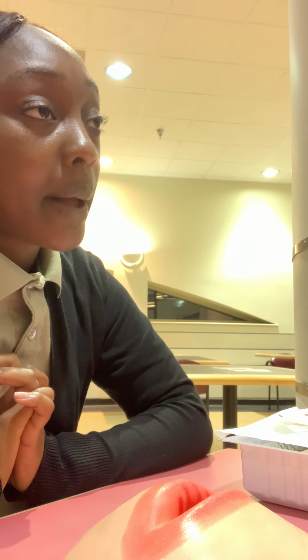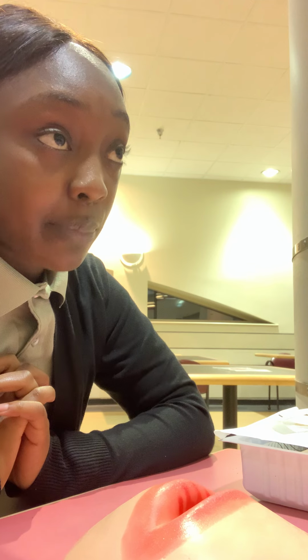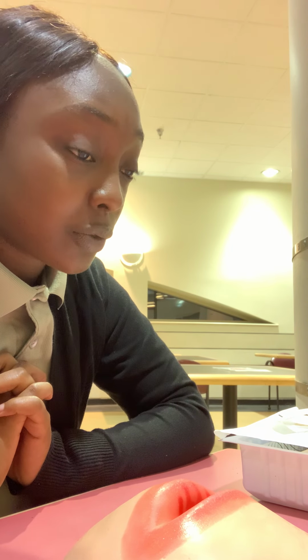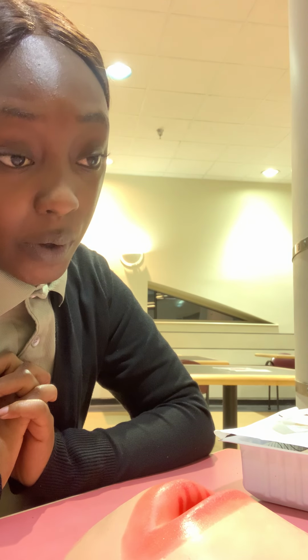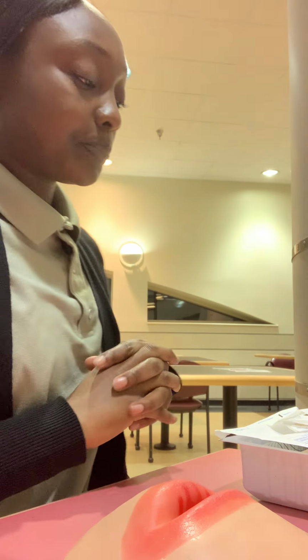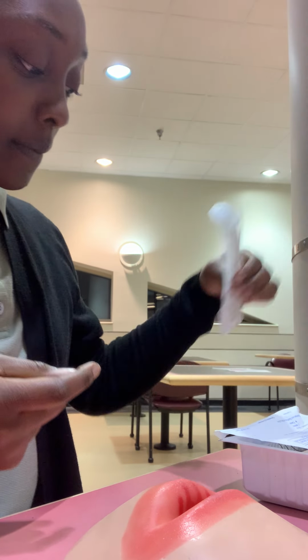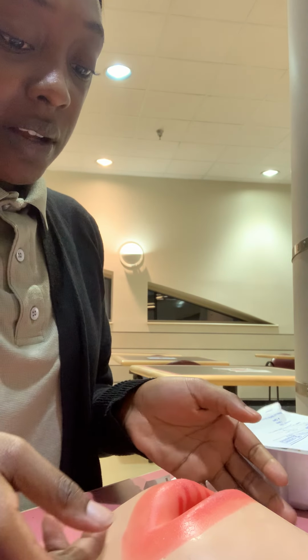Now I'm going to set up my sterile field. Mr. Jones, I'm about to set up a sterile field to clean and pack your wound. I'm going to ask that you refrain from doing any sudden movements or do not touch any of the equipment, okay? Hand sanitizer is on again. So, I do have a clean, flat surface to work on.